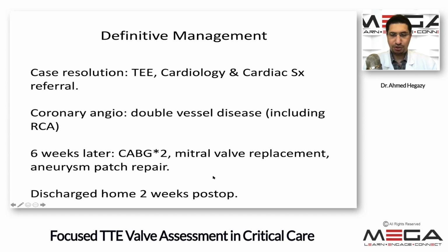So this was a patient that was labeled as ARDS. Turns out that he actually had cardiogenic pulmonary edema, and point-of-care ultrasound was the modality that helped us reach this diagnosis.